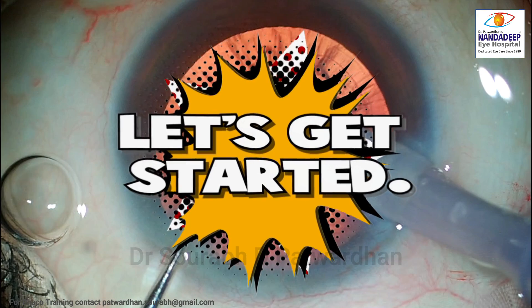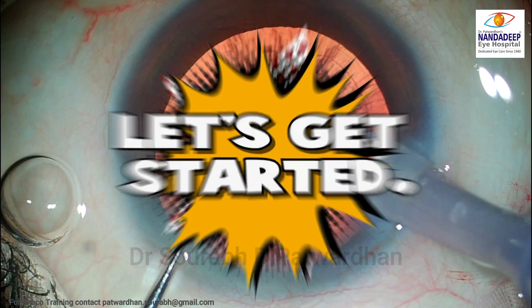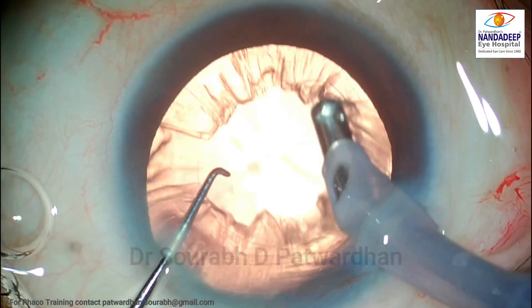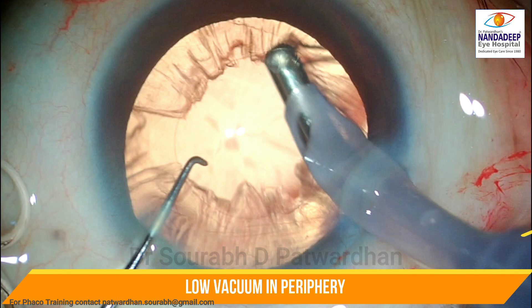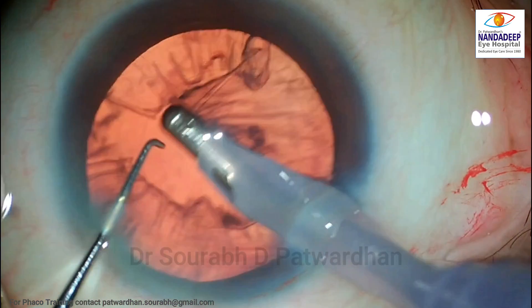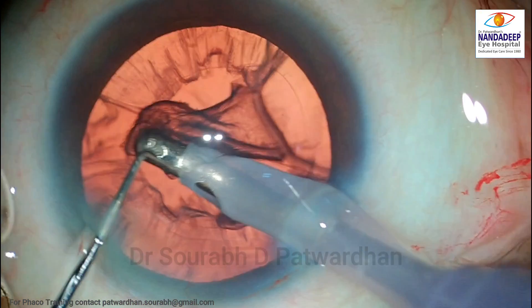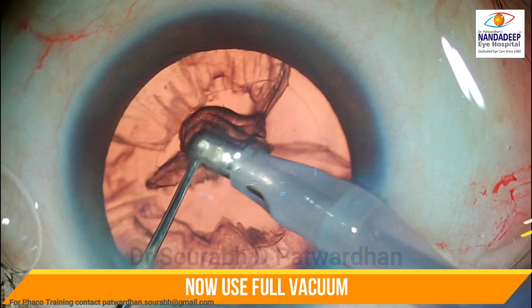Now let us get started with one case and I will show you how proper cortex aspiration can be done using the coaxial IA. Use low vacuum in the peripheral zone. Let the cortex occlude the tip, bring it back into the center, watch for the release of the cortex from the equator, and then in the green zone use the full vacuum.